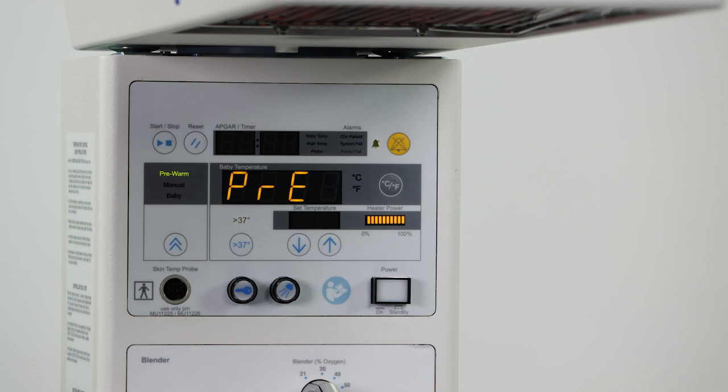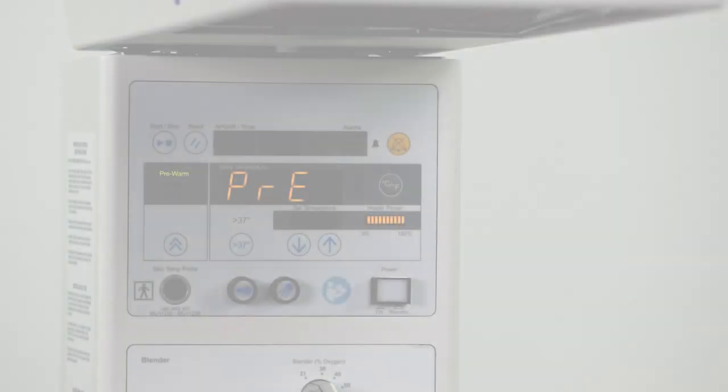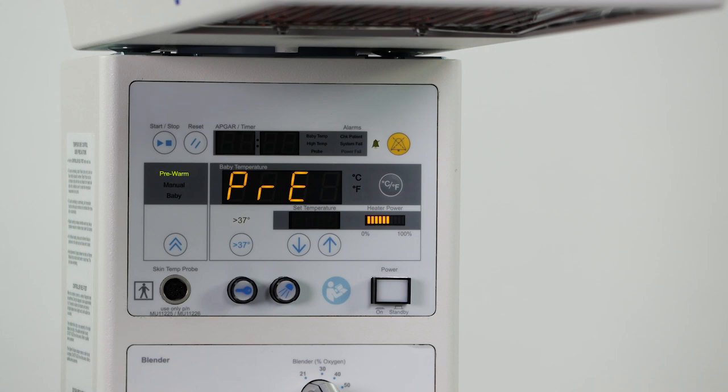The device can be placed into pre-warm mode, allowing the device to warm the bed surface at 100% power output for 3 minutes, followed by 12 minutes at 60%, and then down to 30% thereafter. Pre-warm allows for alarm-free usage.